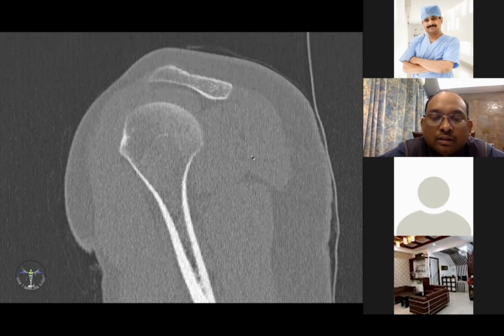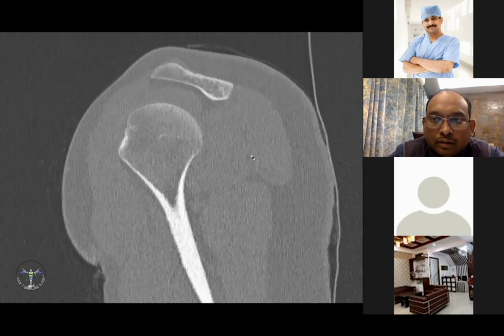Now, when there is a bone loss, what happens? There will be 83% of the remaining glenoid, and that is what will exactly be engaging. Yes, sir, I also thought so, but I have this doubt because we are subtracting that small d from it. If we take 83% of the remaining and again subtract the small d from it, I think we'll be overestimating.